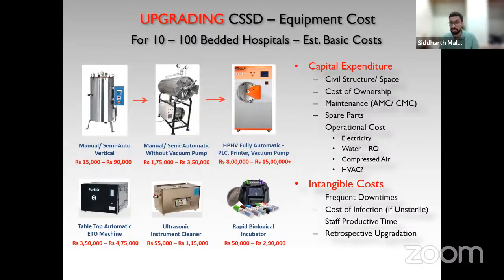So it's okay. But the only thing is vacuuming would not be there. Correct. So drying is not there. A few things may come out wet or moist. Those things ideally are not required or not allowed inside the OT nowadays, sir, because wetness means that a lot of wicking would have happened. Something from outside would have come inside also. And there is no way to understand this because surveillance is very tough.